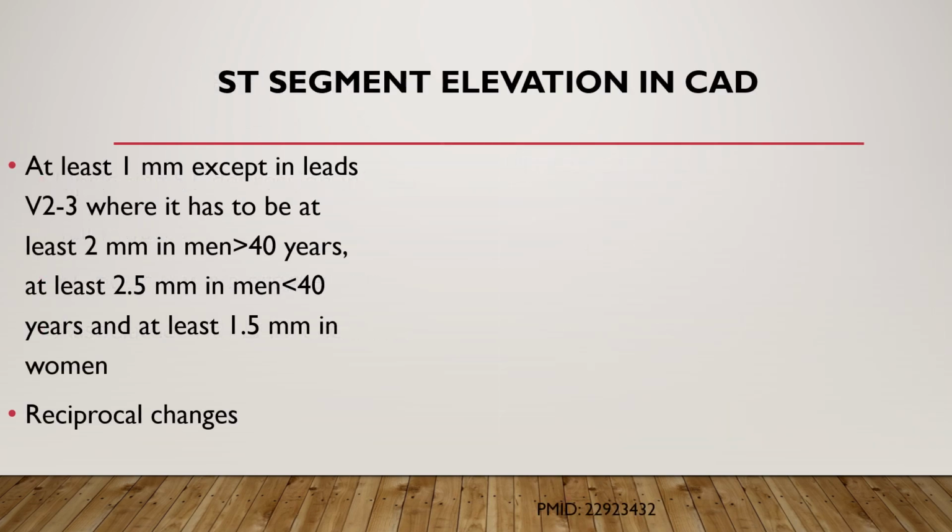Let's talk about ST segment elevation now. It should be at least 1 mm in two contiguous leads except in lead V2 and V3, where it's typically defined as at least 2 mm in men who are older than 40 years old, or more than 2.5 mm in males who are less than 40 years old. And it should be at least 1.5 mm in women.